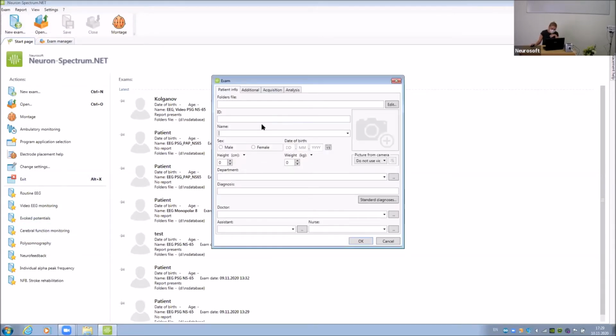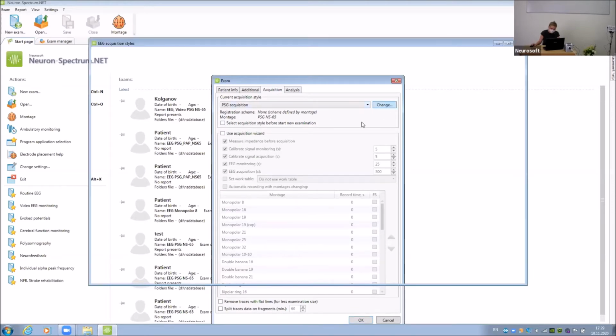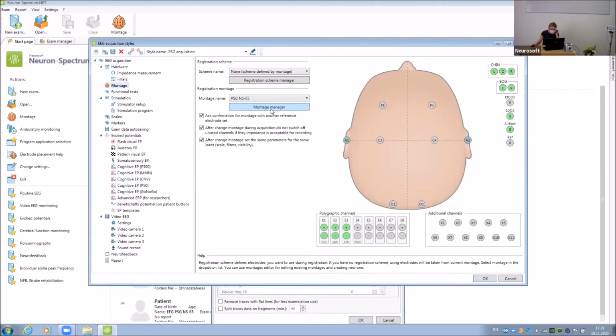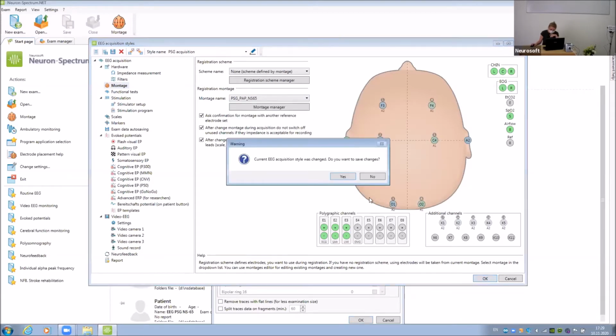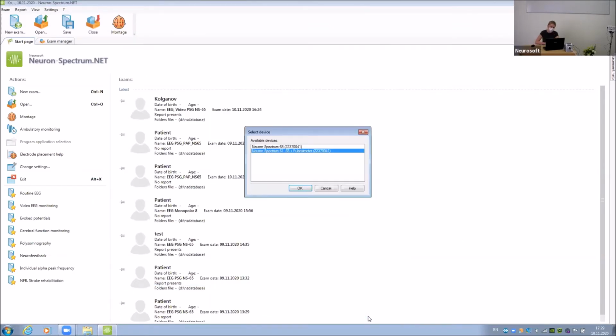And now, very important for us to choose another montage. I have created this montage before. So now we can start our acquisition.